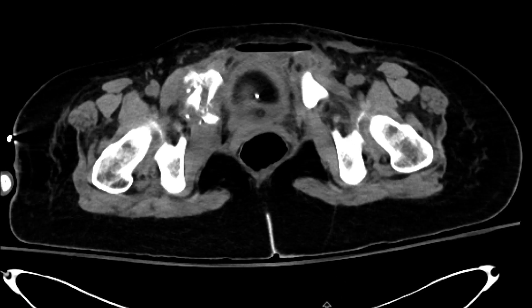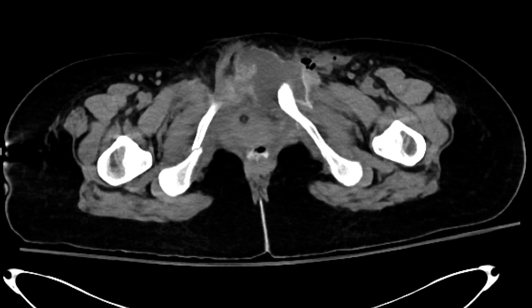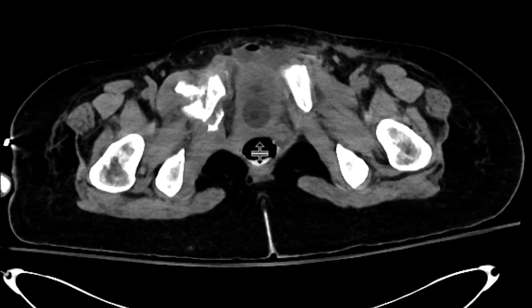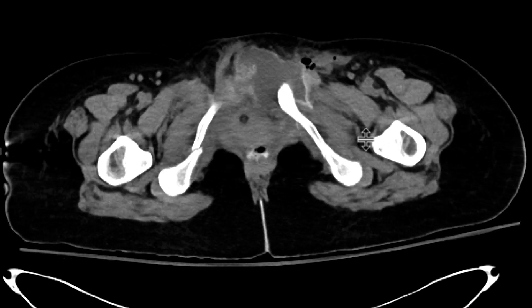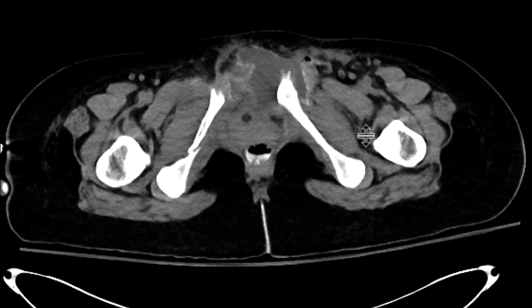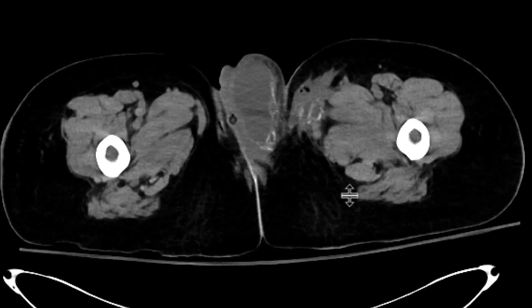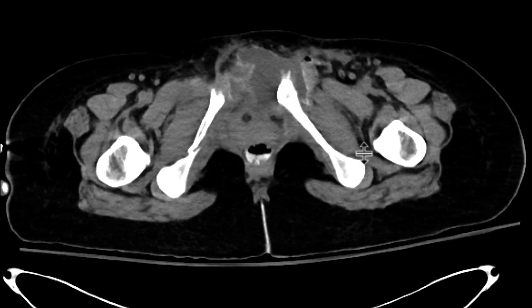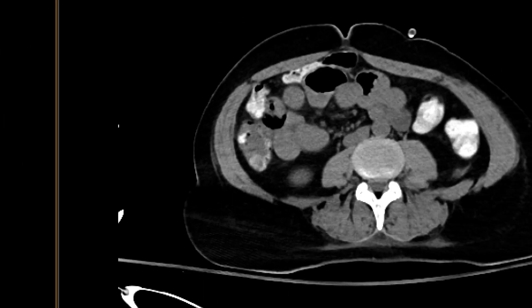There are still some traumatic injuries to the pubic bones — there's pubic diastasis. A Foley catheter is present within the bladder, and we can see that there's lots of this low-density fluid extending outwards from the region of the bladder, going all the way downwards to the left labia and to the subcutaneous tissues of the pelvis as well.